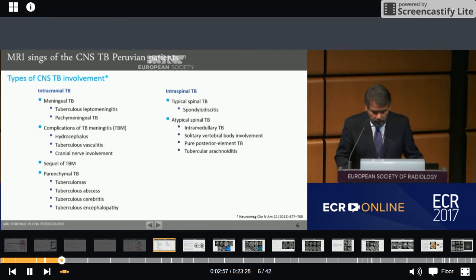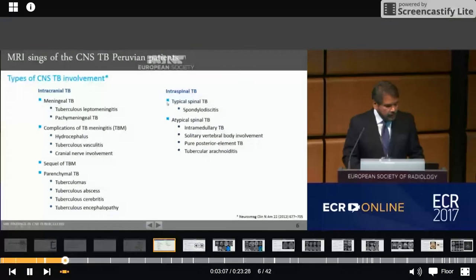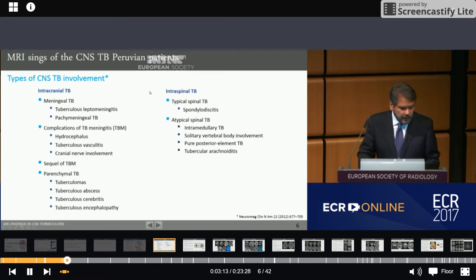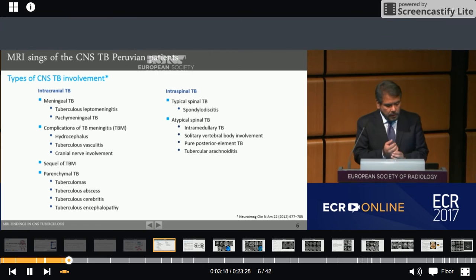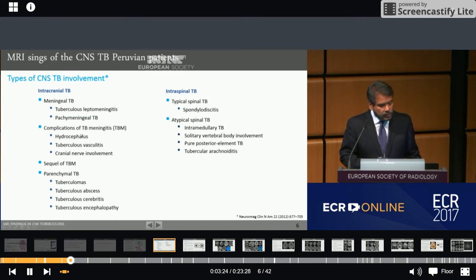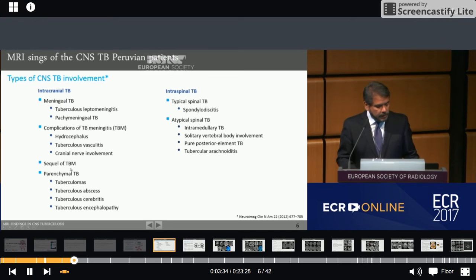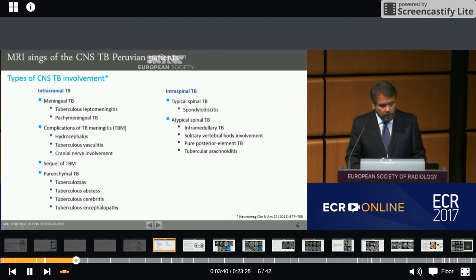Imaging of CNS TB can be divided into different types of involvement: intracranial TB and intraspinal TB. Within intracranial TB, there is meningeal TB with tuberculosis leptomeningitis, pachymeningeal TB, complications of TB meningitis such as hydrocephalus, tuberculosis vasculitis, cranial nerve involvement, sequelae of TB meningitis, and parenchymal TB including tuberculomas, tuberculosis abscess, tuberculosis cerebritis, and tuberculosis encephalopathy.